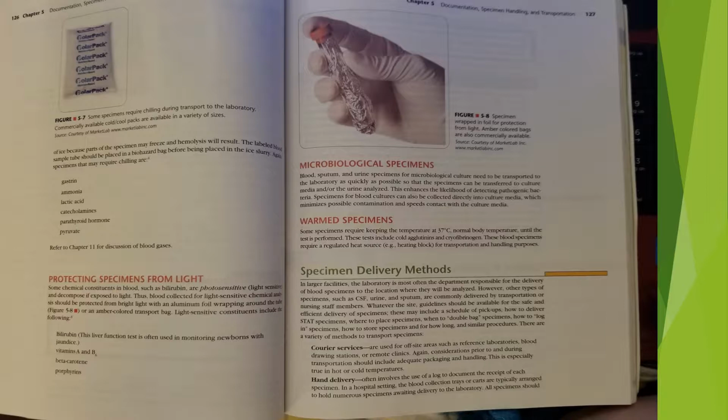Protecting specimens from light. Some chemical constituents in blood, such as bilirubin, are photosensitive or light sensitive and decompose if exposed to light. Thus, blood collected for light-sensitive chemical analysis should be protected from bright light with an aluminum foil wrapping around the tube, such as figure 5.8, or an amber-colored transport bag. Light-sensitive constituents include the following: bilirubin. This liver function test is often used in monitoring newborns with jaundice. Vitamins A and B6, beta-carotene, and porphyrins.